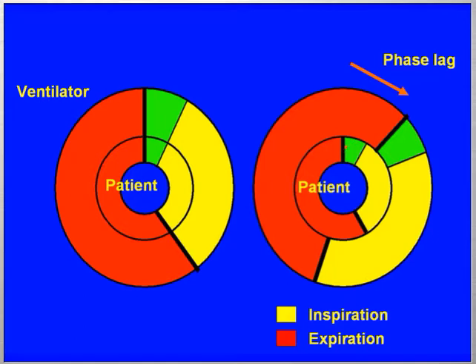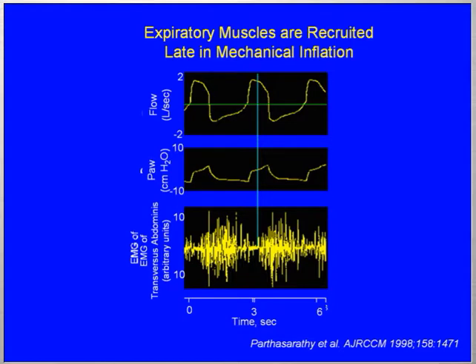We already talked about how there can be a prolonged inspiratory delay when the ventilator is triggered. We talked about the post-trigger phase. But what happens is that inspiration starts early and ends early. And what that means is that expiration starts early as compared to inspiration. And this period of overlap is what we see in the next slide.